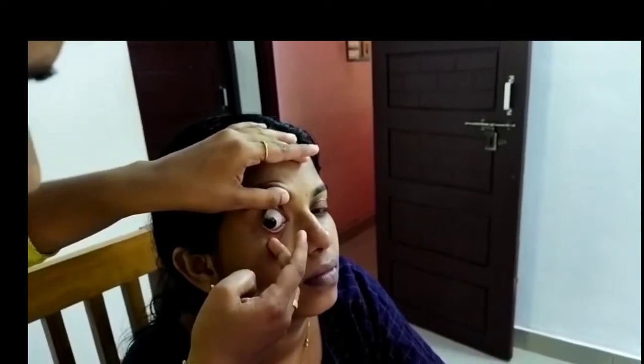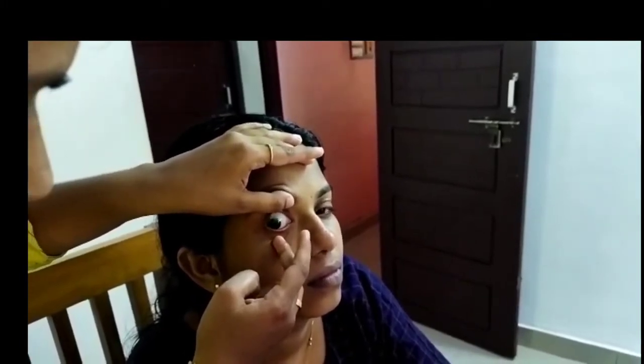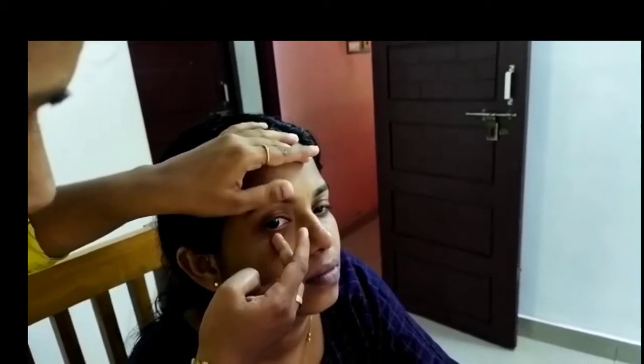Then slowly release the upper and lower eyelid, and slightly massage the patient's upper lid to ensure the lens is in the correct position. Educate the patient about the adaptation period, as they may or may not experience asthenopic symptoms. Ensure the patient is comfortable and inform them of the next steps.